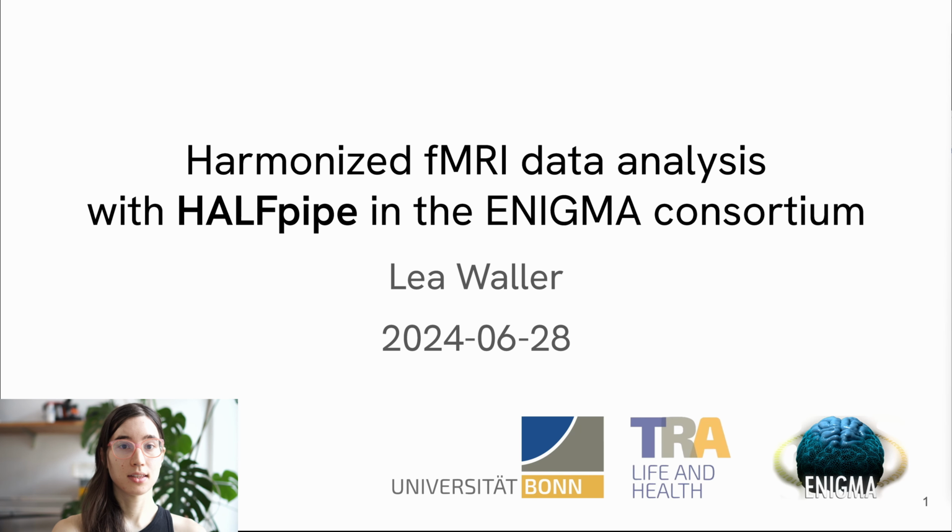So the reason I think this is interesting is that fMRI is one of the few ways that we can use to interrogate the human brain in vivo and discover biomarkers of mental health and psychological states and traits. But the processing of fMRI involves numerous steps to get to usable outputs. That means, unfortunately, that there's been a lot of heterogeneity in how people approach this processing and how they configure each step.